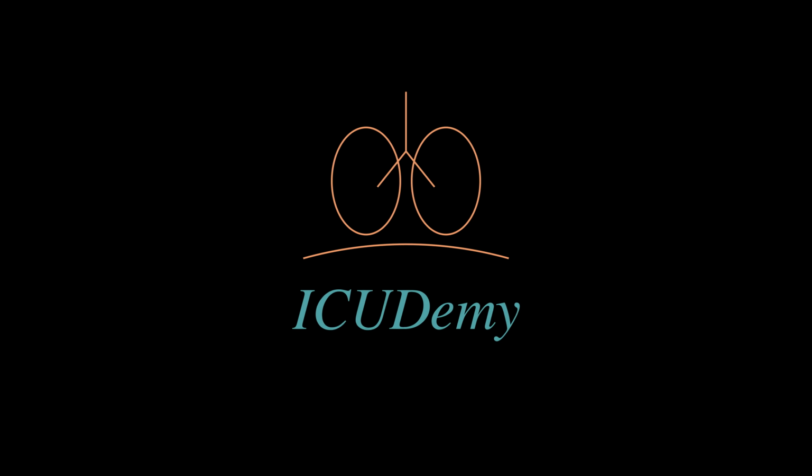That concludes our module on ventilating restrictive lung disease. Remember, the key is to protect the stiff lung, keep volumes low, pressures limited, and let driving pressure guide your settings.